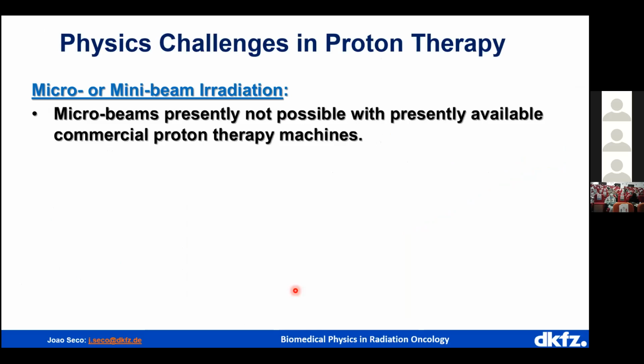So microbeam, presently, no one really understands why they are used, and at the moment the technology for it to go into the clinic is still a bit far away, but it can have a major impact in some of the hardest cancers, like in the brain, when you have gliomas and other types. And it's also amazing for sparing organs to radiation side effects.